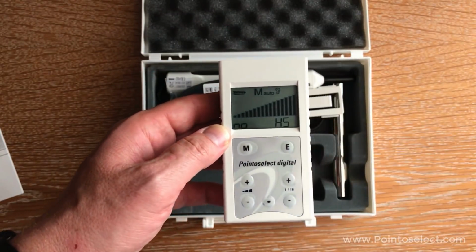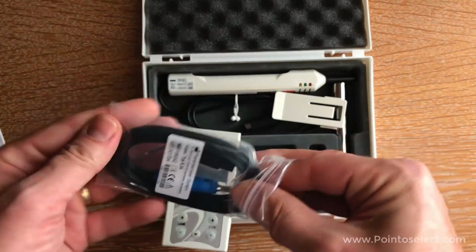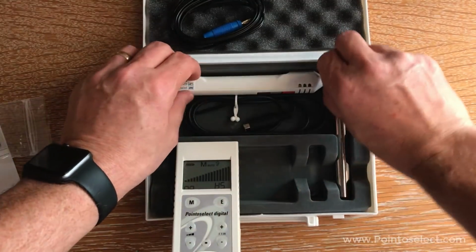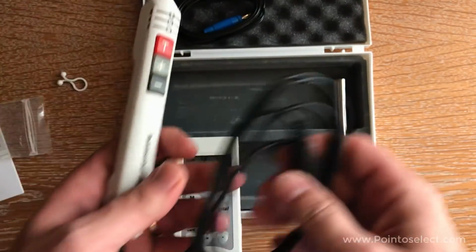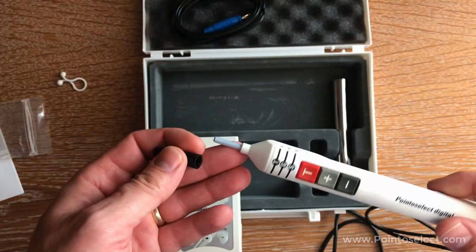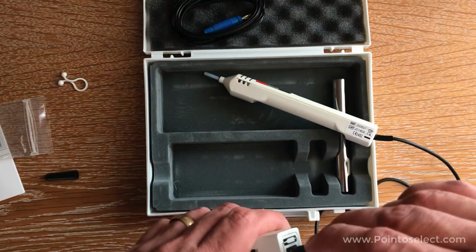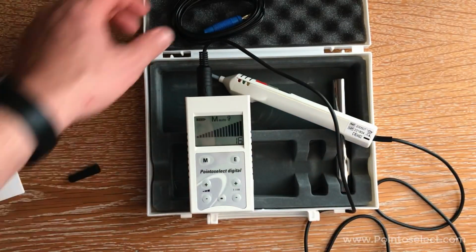And it's saying no HS, no handset, of course, because we haven't plugged in the handset. So we've got our ground cable here, and we'll put on our belt clip. There we go. We've got our handset here. All right. Looks very much the same. The printing's different. The color on the buttons are different. Just plug her on in and get rid of that. There we go. Okay. Yep, no longer complaining about no handset.